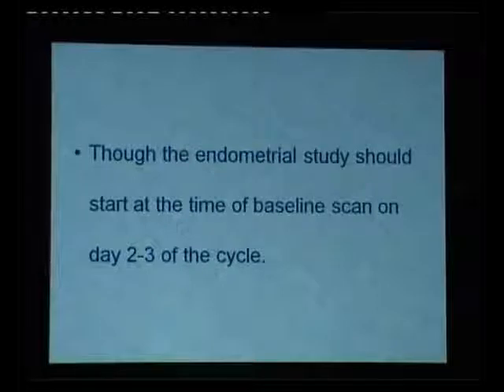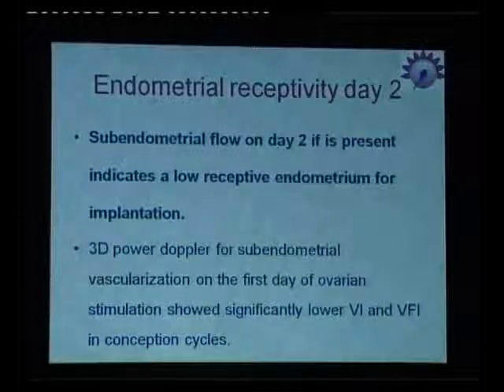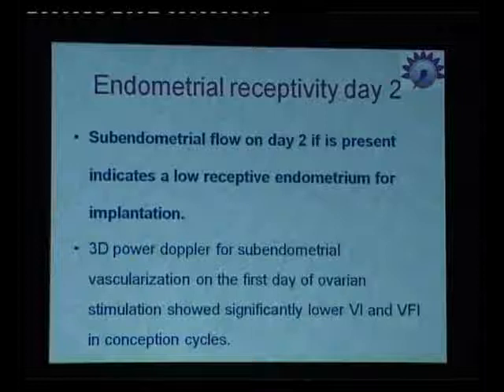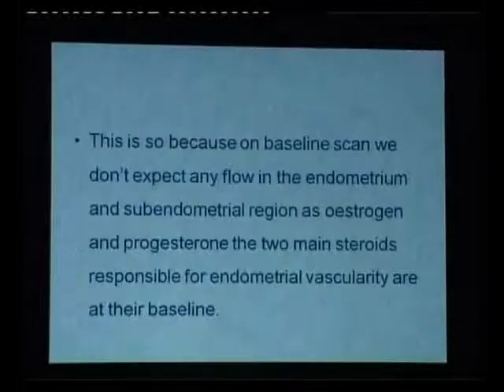A lot of it has been already discussed by Dr. Vivek, but I want to specify that you must not see any blood flow in the endometrium on the Day-2 scan, in the subendometrium or in the endometrium. And these have been proved in the studies done just on color Doppler and also on 3D power Doppler. The study on 3D power Doppler says that if there is any subendometrial vascularization on the baseline scan, the pregnancy rates are lower in those patients.